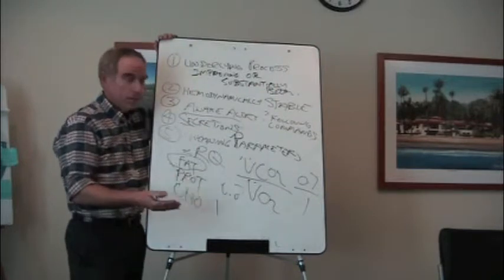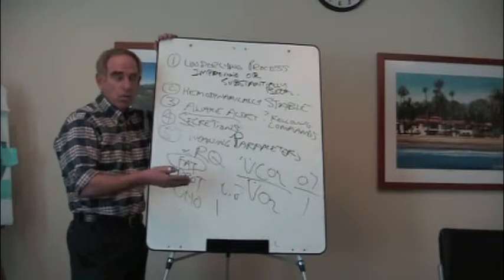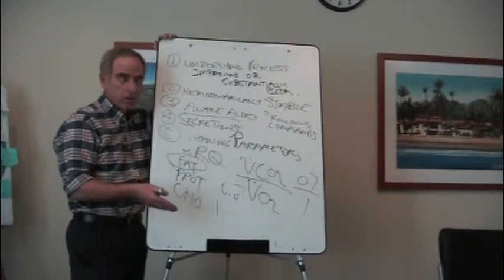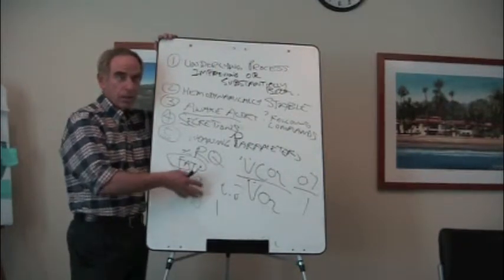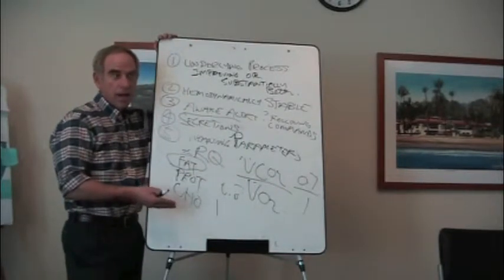Okay? So if you have somebody that has a high CO2 or has a high minute ventilation, you have to decide, well, why do they have a high minute ventilation? You're trying to wean them. You have to think about which of all of these factors that I just talked about they have.